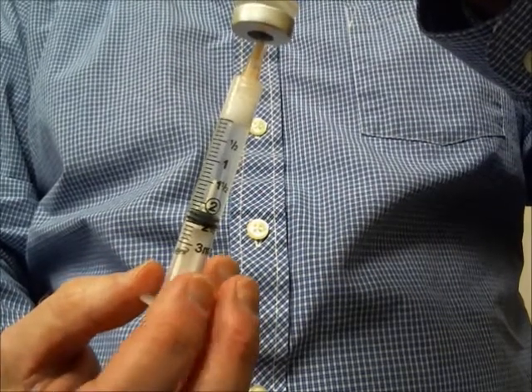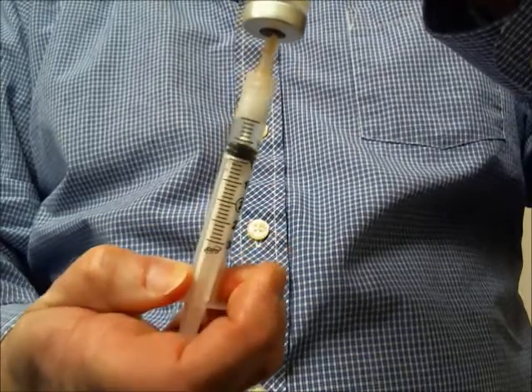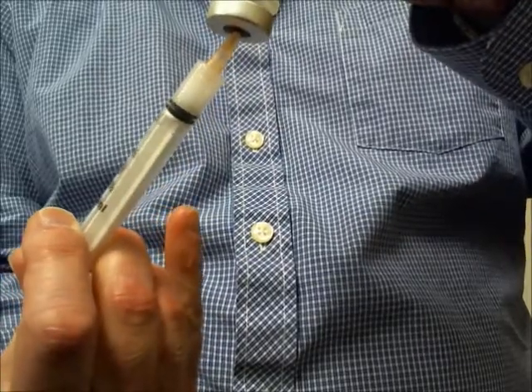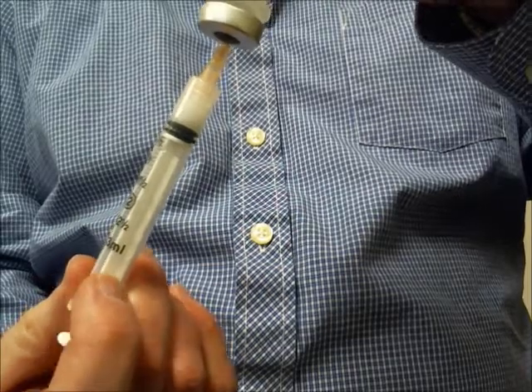Now, when I complete the injection, I am going to push the plunger all the way in. You will hear a little click. You will feel it as well. That safety feature is now activated.